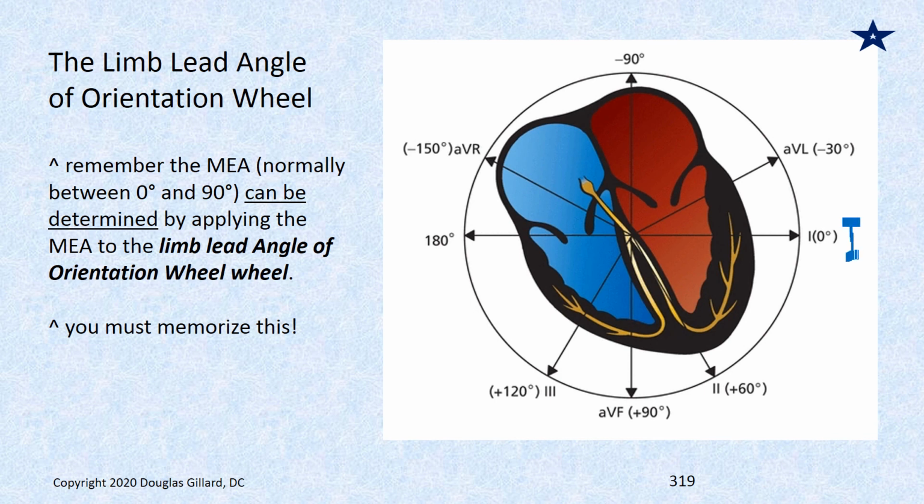Everybody stick your left arm straight out, 90-degree angle between your arm and the floor. In other words, your arm is parallel to the floor. That is the vision of limb lead 1. If limb lead 1 is a camera, it's looking at the heart in that direction. Therefore, it'll usually see the flow of electricity kind of obliquely.